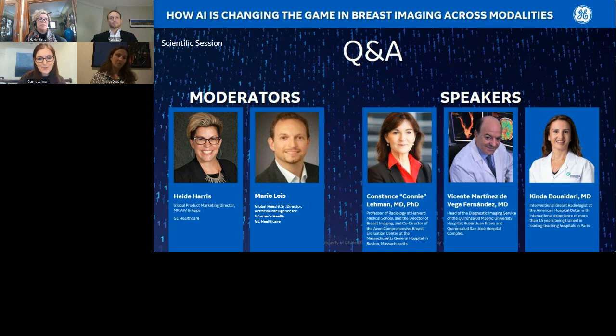Yeah, I totally agree with that. We also use ABIS. We're still using ABIS, in maybe a slightly different application. It's in the diagnostic setting. We have centers where we don't have subspecialized radiologists on site, and there's, as you know, a lot of human variation with handheld ultrasound, and this allows our technologists to give us a 3D volume in an area of concern, either from the mammogram or the clinical exam.